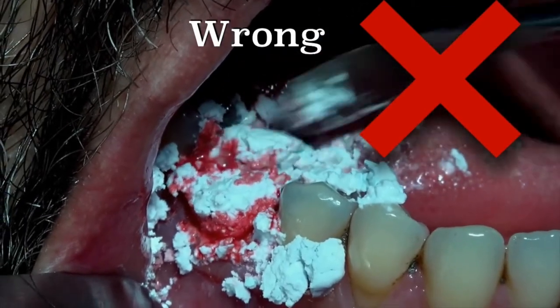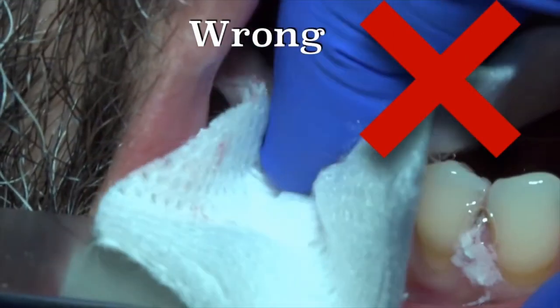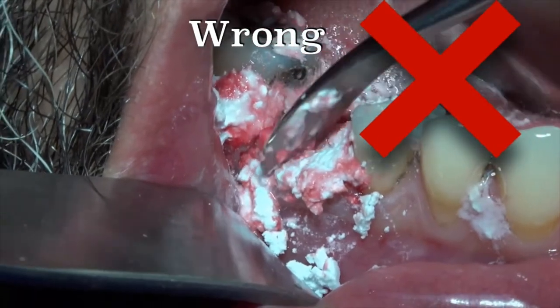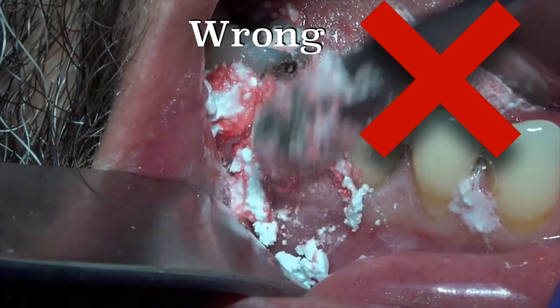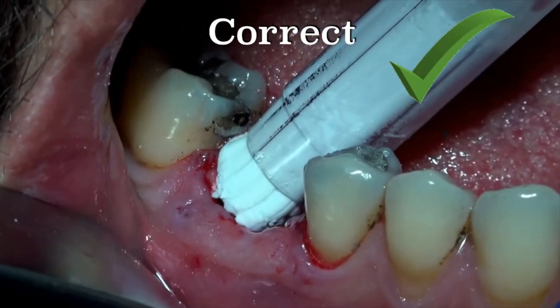So this is the wrong way to do it. And of course, don't use a tool to push down the material into the bottom of the socket. This is something that shouldn't be done when you work with cement. With granules we used to do it, but with cement, no. Here is the correct way.